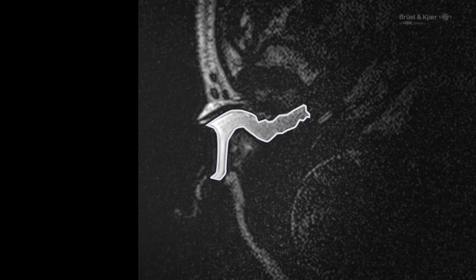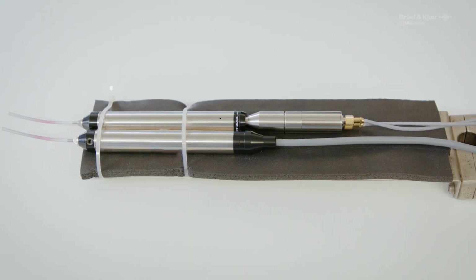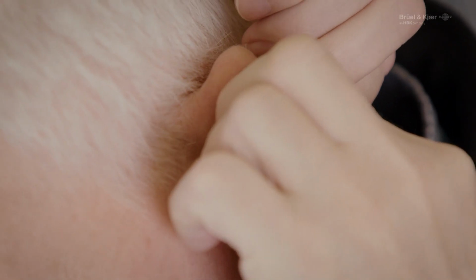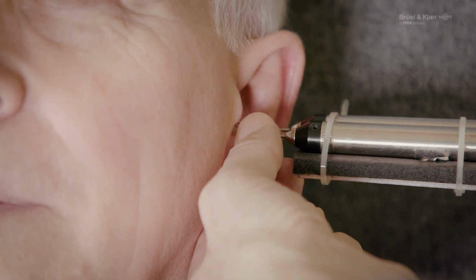This required the application of a specially designed impedance probe which required precise positioning in the ear canal. To do this, individual earplugs for each subject were molded using extracted geometries from the MRI measurements. Each plug was designed to position the probe as close as possible to a common reference plane 19 millimeters from the eardrum. The impedance probe itself was created using 2 probe microphones, one to measure the response and the other adapted to act as a sound source. A coiled tube in the measuring probe housing provided for a smooth frequency response and a high acoustic impedance at the probe tip. The tips of both probes were mounted flush with the bottom of the ear molds, and with the right calibration and a little math, the impedance of the middle ear could be measured.